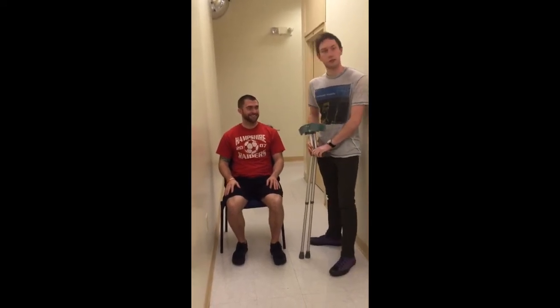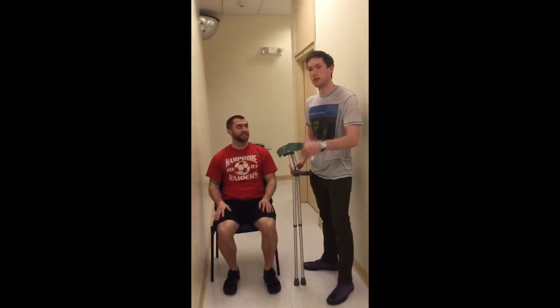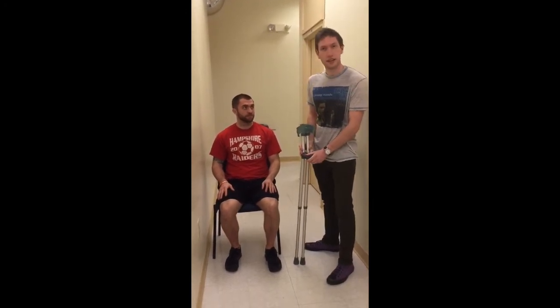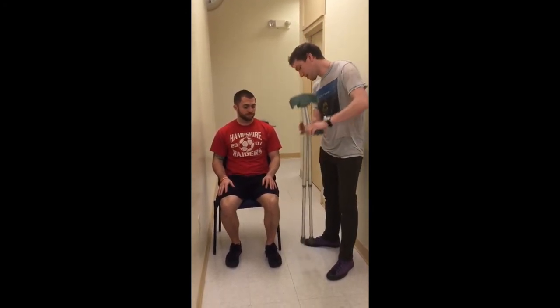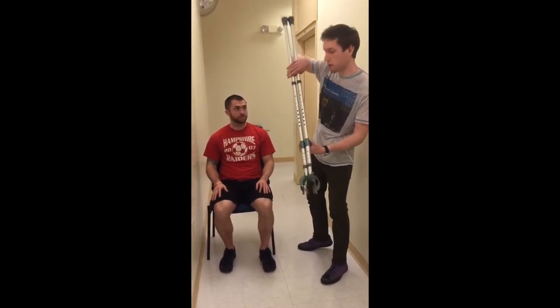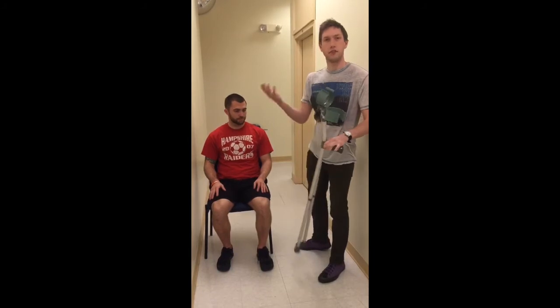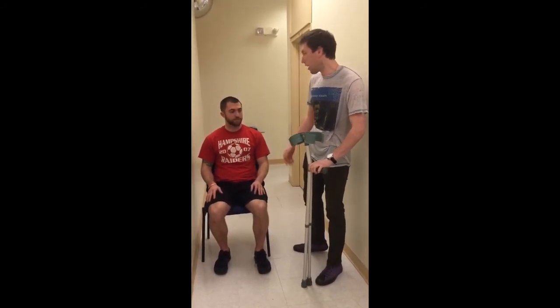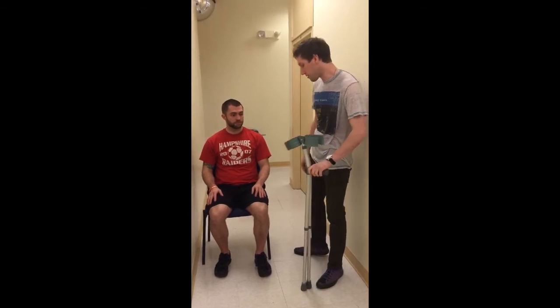Today we're going to learn about how to fit Lofstrand crutches. So what we're going to do, similar to how we initially work with the axillary crutches, we're going to get the patient standing to initially fit. These don't really have a height gauge on them, unlike some of our axillary crutches, so it's tough, even if you ask the patient how tall they are, to kind of get an estimate for how to fit these.